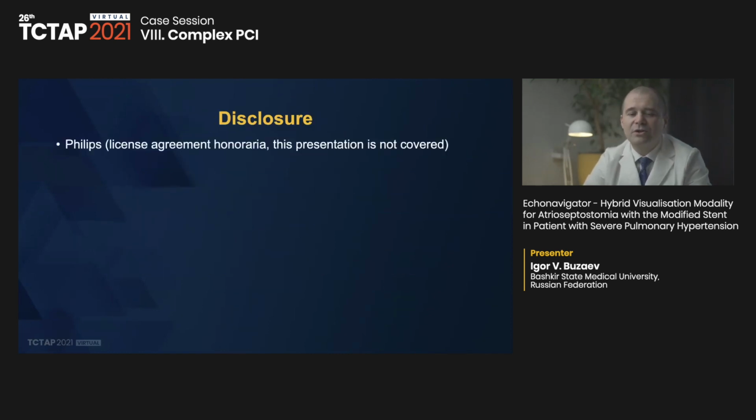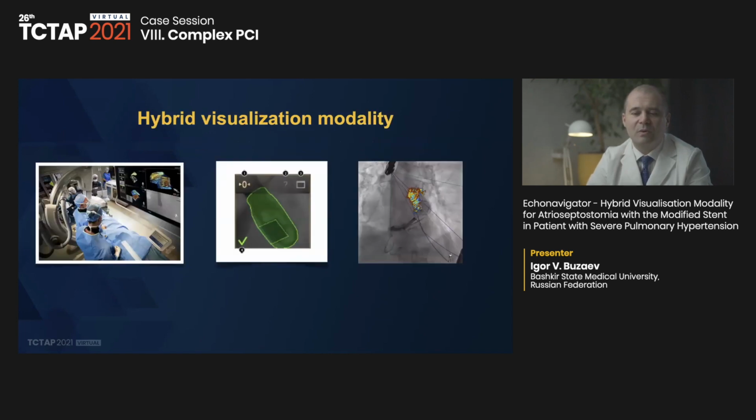To solve the problem, usually the doctor looks at the fluoroscopy and then changes the view to the echocardiography picture. But it is not very useful because sometimes we need to see relationships of our instruments, catheters, wires with soft tissues and flows. We see the instrument without soft tissues on fluoroscopy, but we see the catheter as a small point or circle on the echocardiography.